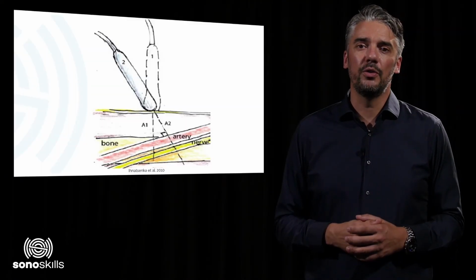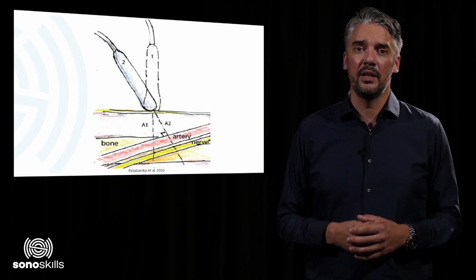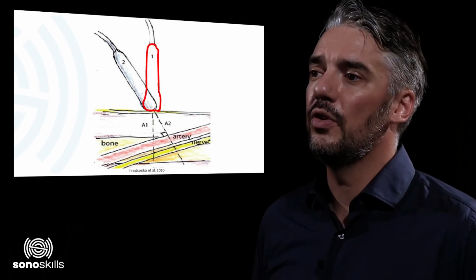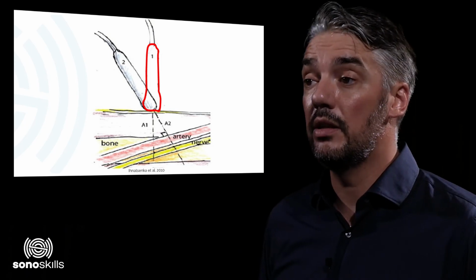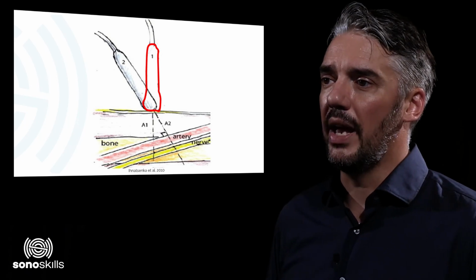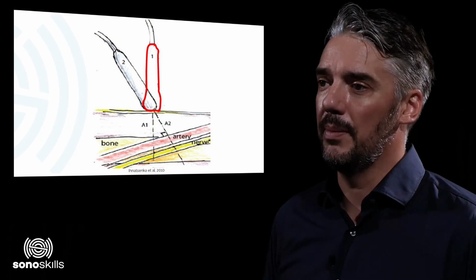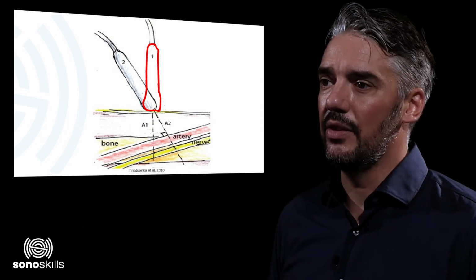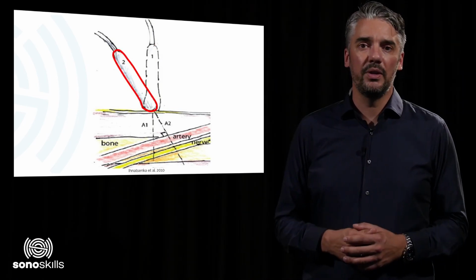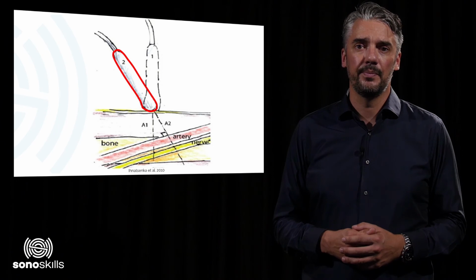The angle of the transducer's position is always referred to the anatomical structure that you have to scan. It's not related to the skin. This image shows a transducer that has a perpendicular 90-degree angle with the skin. But the artery and nerve, which it should scan, are scanned under an incorrect angle of incidence, leading to anisotropy. If you would like to scan this artery and nerve optimally, then the transducer has to be tilted to the point that it scans the artery and nerve perpendicularly.